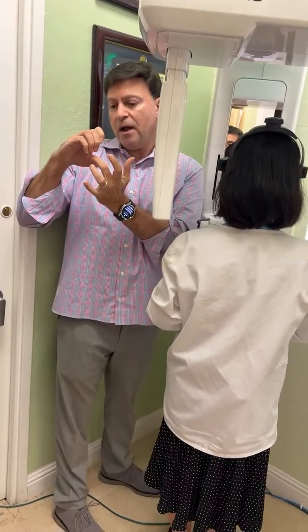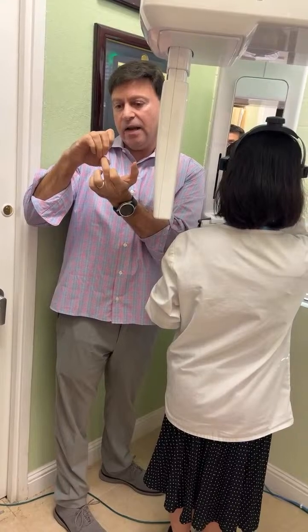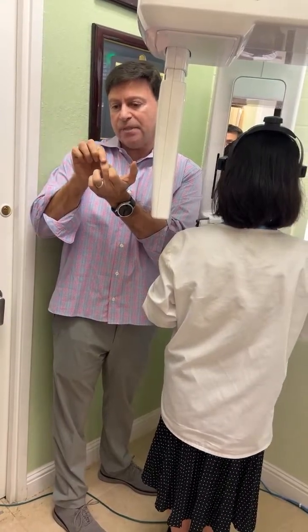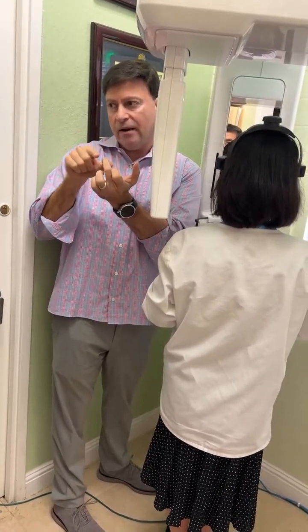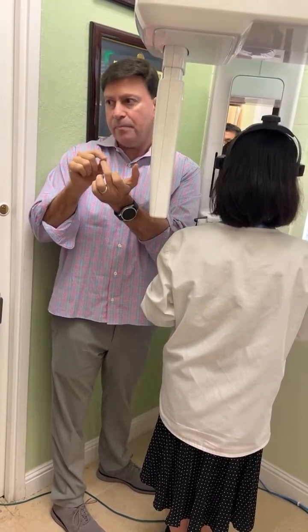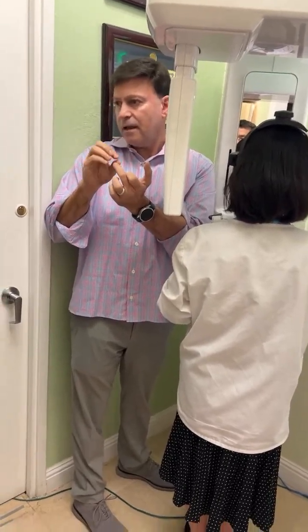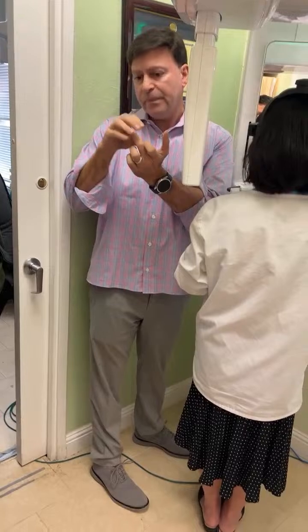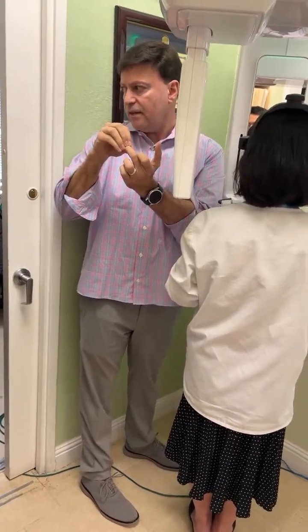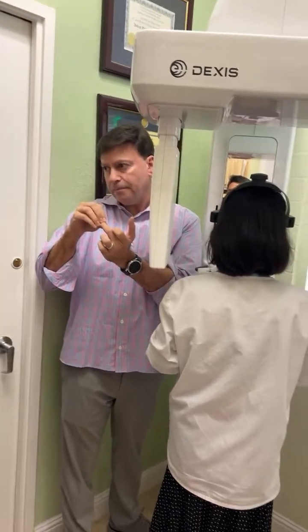If you open your mouth and leave your lips open like this, even though the teeth are here, radiation escapes out of the front of the mouth and you'll see burnout here. Your incisors will look all black on the edges, the outline of the lips. You'll try to lighten it up in the software and you can't correct it. It went right through and burned through it. That's why the lips have to close that area, so you don't get that burnout area. That's why we tell them to do it.